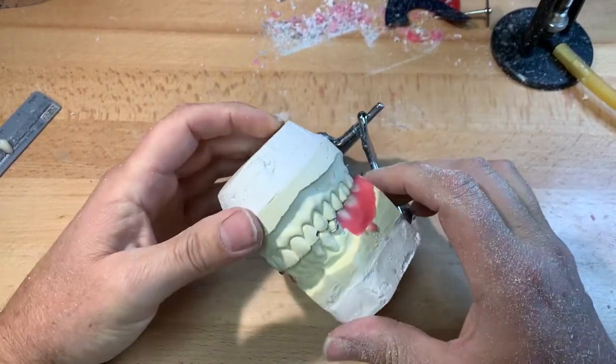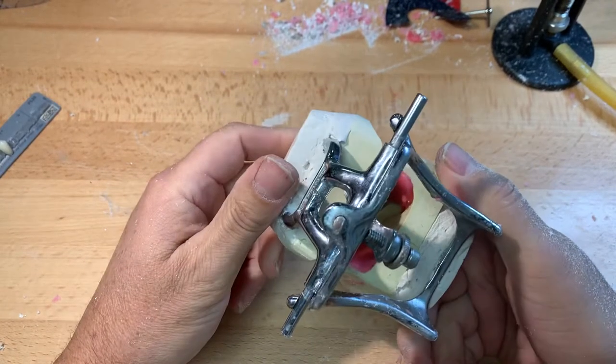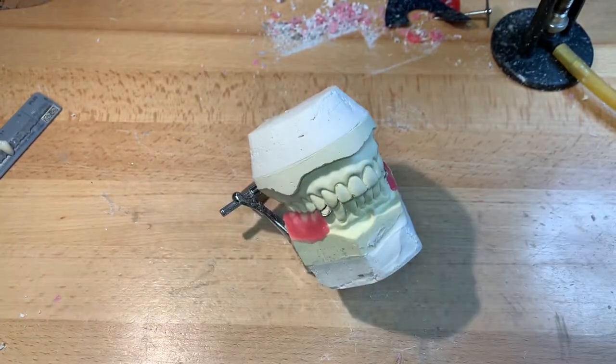We've completed our setup for project one for Trion. I've evaluated that the contact is maximized and even all the way around, as well as the natural dentition is equal to that of the prosthetic occlusion, or the prosthetic dentition.